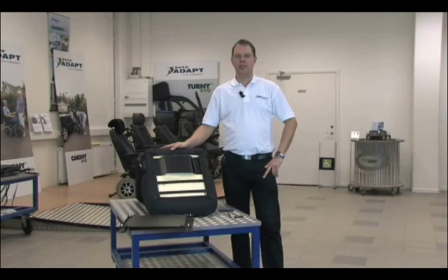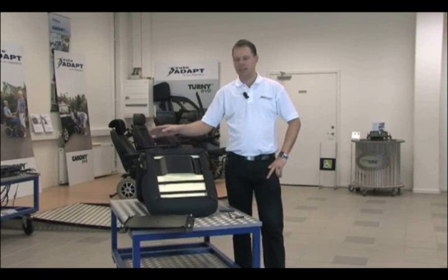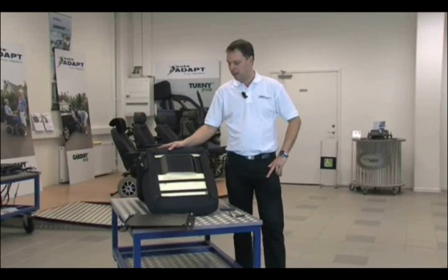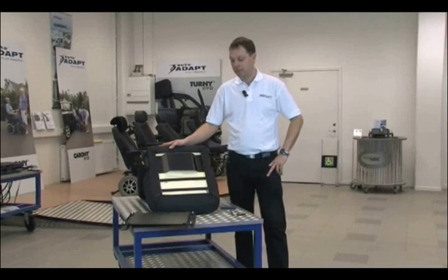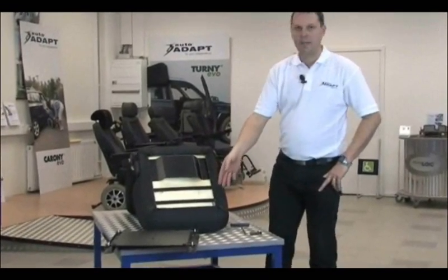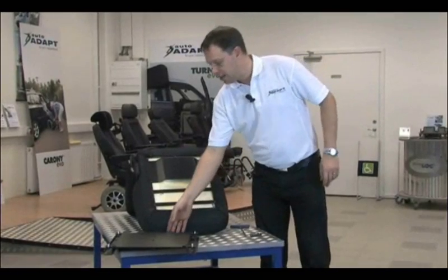I will now show you how to install the Carony carriage on the seat. Even if I have the brand new compact seat right on the table here, it could be any seat, you know, the BEV seat, the LP seat, the Recaro seat, whatever you fancy. In front of me I have the Carony carriage, which I released earlier.